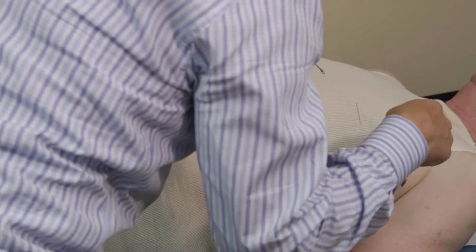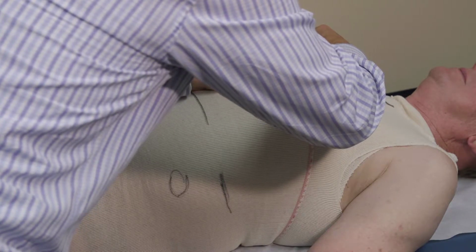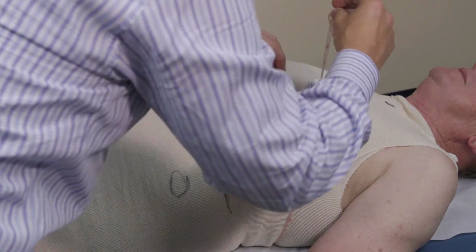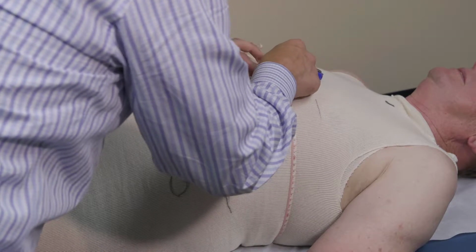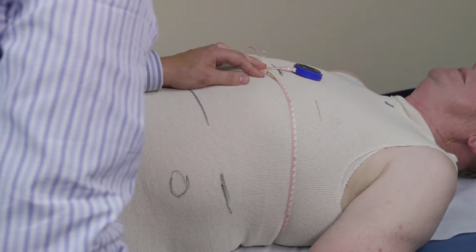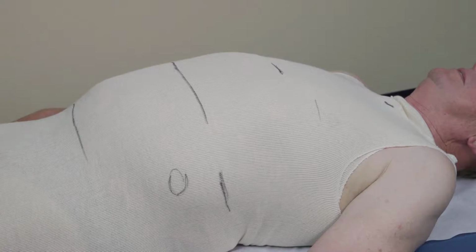You okay? Okay. So the circumference at the xiphoid process, I'm a little high right there. The xiphoid is a little bit twisted, but basically it is 43 5/8. 43 5/8.